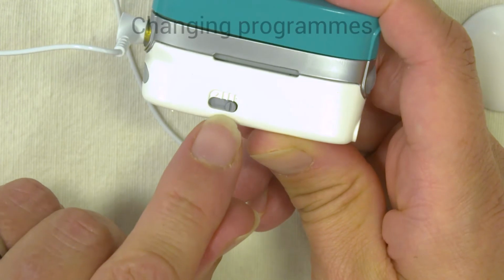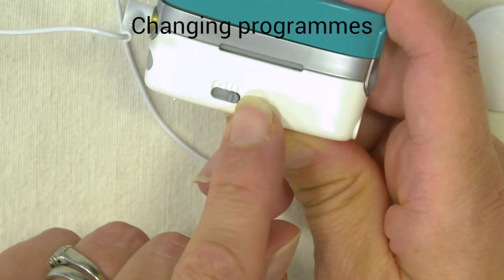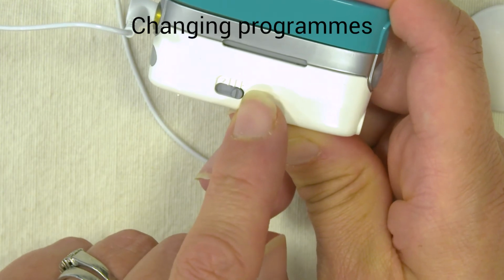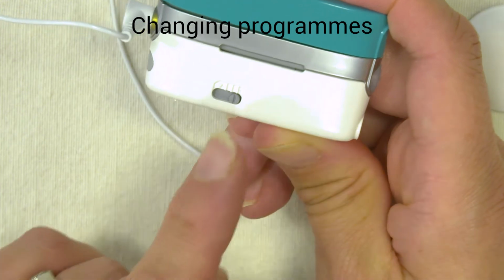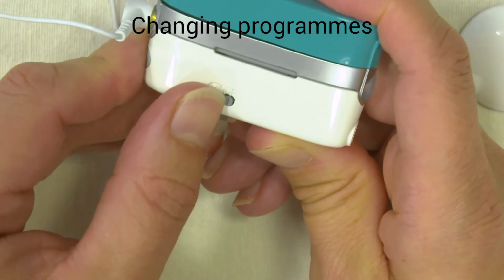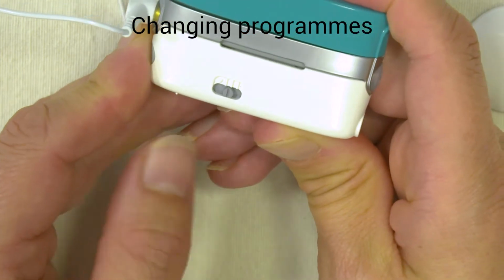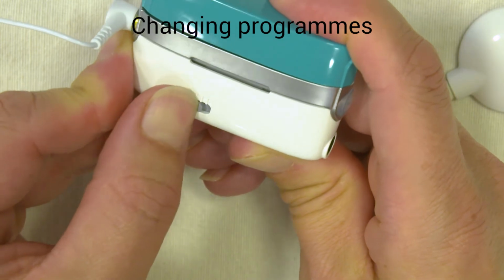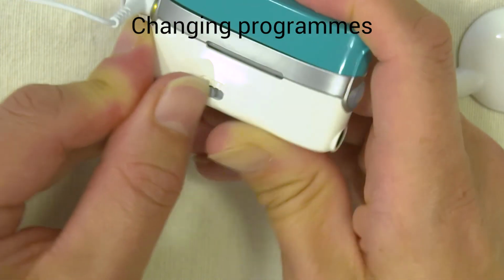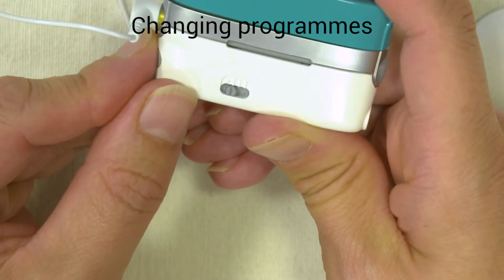In order to change the programs, you use this little switch here. It's currently on program 1. Program 1 is furthest away from the coil. You move the program button once, and that's onto program 2. Again, slide it over once, and that's program 3.